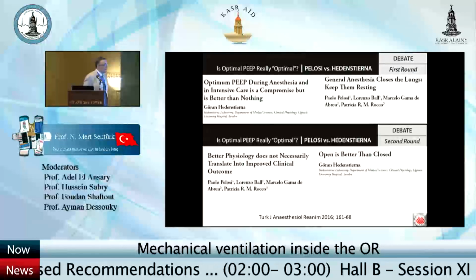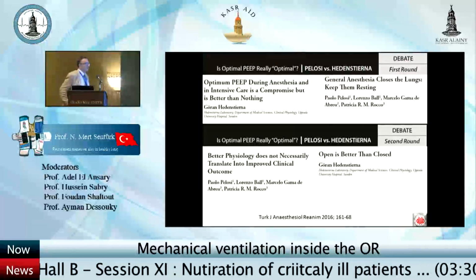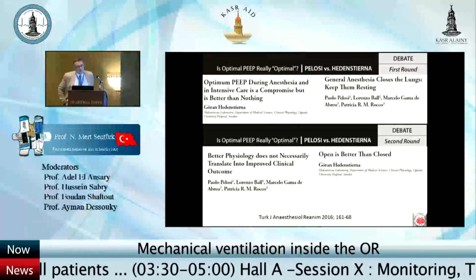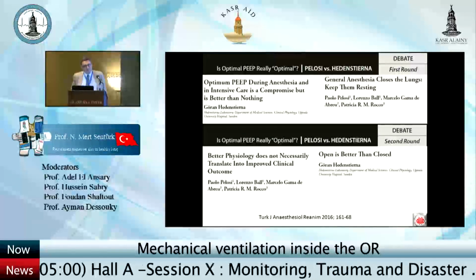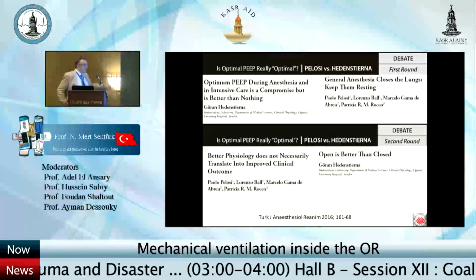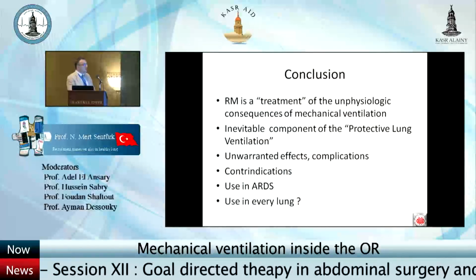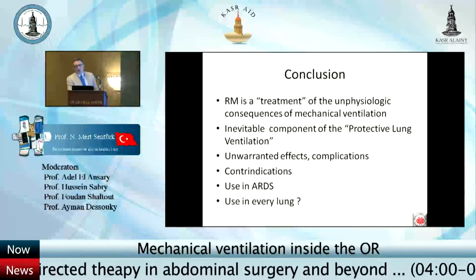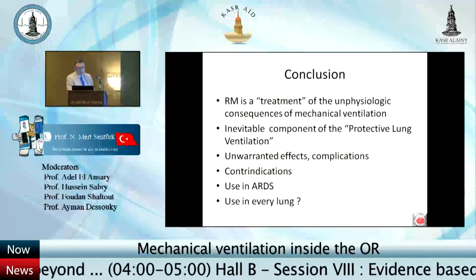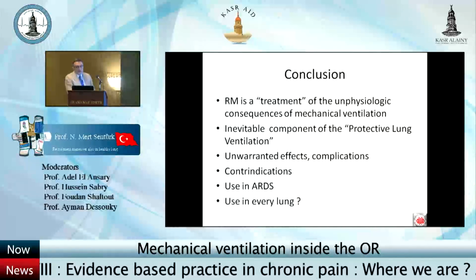And this has led to a discussion between the advocates of protective ventilation with recruitment maneuver and PEEP versus the ones who think that there can be a difference between healthy lungs and ARDS lungs. And this has been a discussion also in some journals. So the conclusion is: recruitment maneuver is a treatment, also with some complications and contraindications, of the unphysiologic consequences of mechanical ventilation, even in healthy lung.